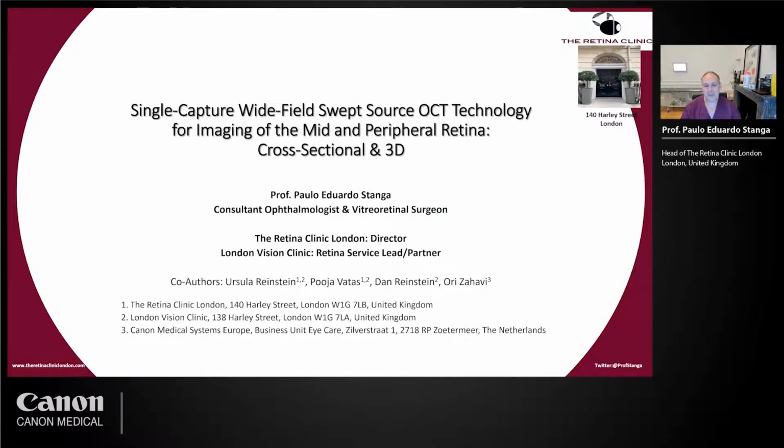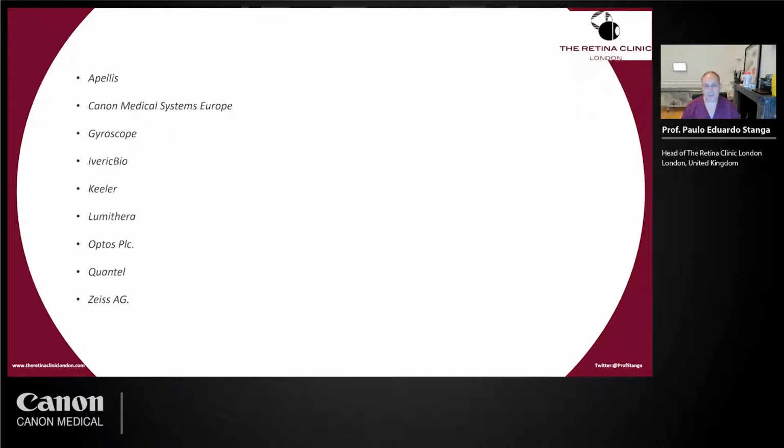Thank you very much, Ori, for this invitation, and thank you very much to the Canon team for working with us. Welcome, everyone. Let me share with you our experience in imaging the peripheral retina using this novel technology, single capture wide field swept source OCT, with which we try to image the mid and peripheral retina.